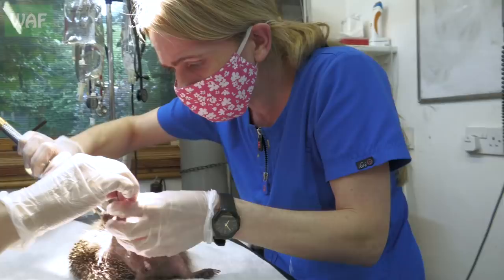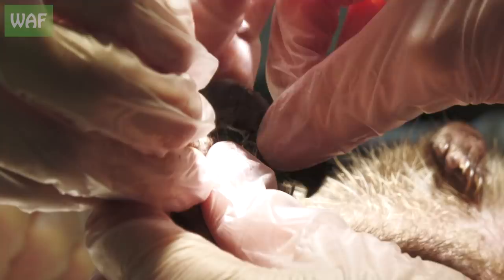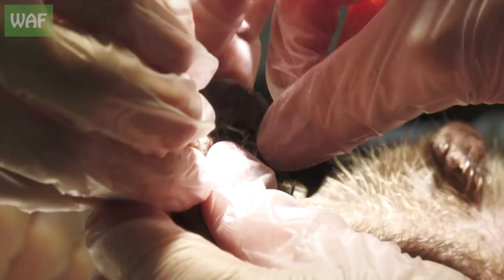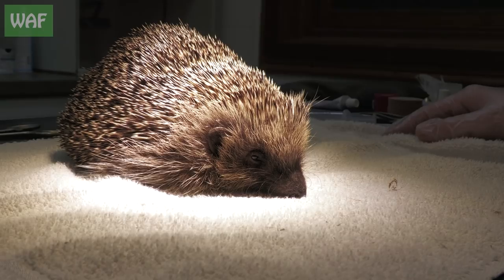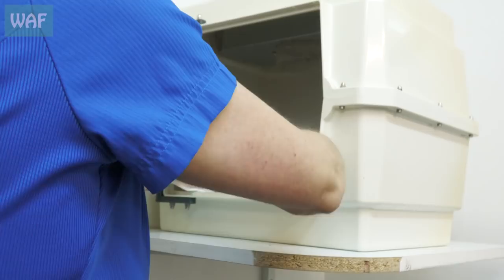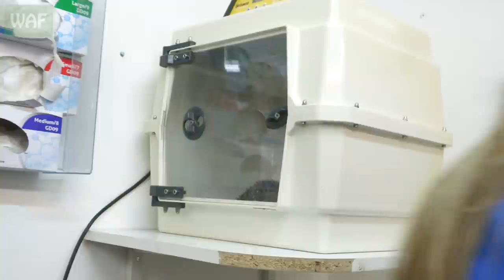After five weeks of recovery, it was finally time for Sally to remove the fixator. This is always a nerve-wracking time for the team as we wait to see if the hedgehog had regained full mobility. The fixator has been removed — it all went very smoothly and it all looks fabulous. We've given him just a bit of anti-inflammatory pain relief for this evening because moving all those pins through tissue would have caused quite a bit of discomfort. Hopefully over the course of the next week we'll start to have a nice walking hedgehog.